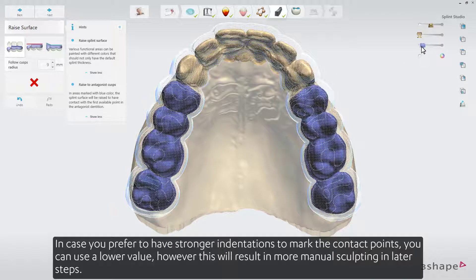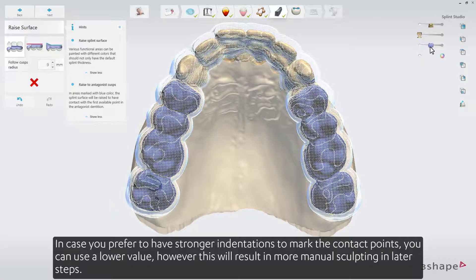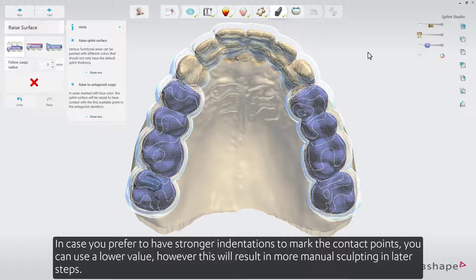In case you prefer to have stronger indentations to mark the contact points, you can use a lower value. However, this will result in more manual sculpting in later steps.